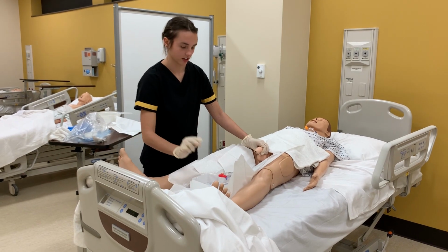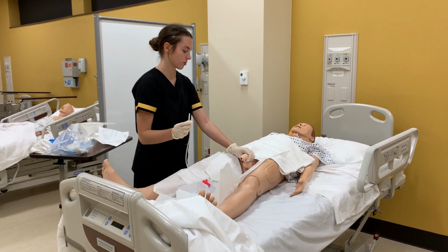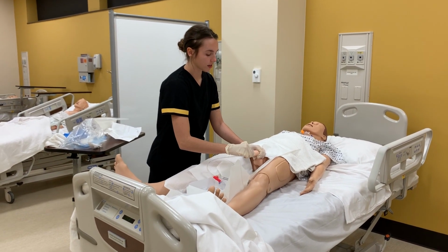In real life, you would insert the whole syringe. And now we're ready to begin. So we're going to insert it, so just take some deep breaths and we'll get it in there as soon as we can. So here we go.